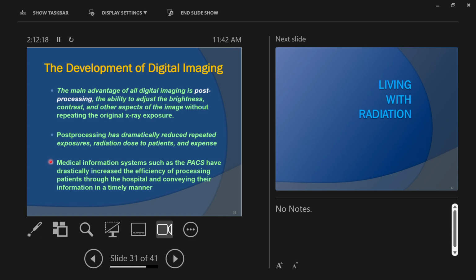We'll just completely take it for granted from this point out. But to think about where it came from to where it is now, it's changed quite a lot. Literally just in the time that I've been in X-ray tech, we've gone from using film quite a lot to really exclusively not using film at all anymore. I know I don't have any clinical sites that still use film for you guys, and there are very few physicians' offices that may even still use film because of this need to be able to transmit things electronically pretty much across the board now.